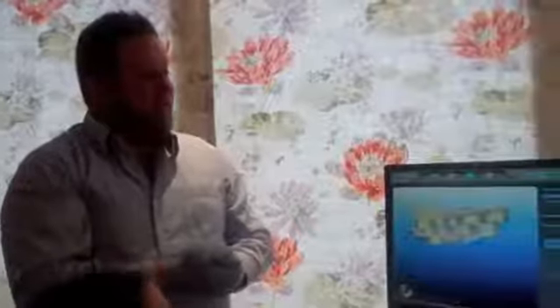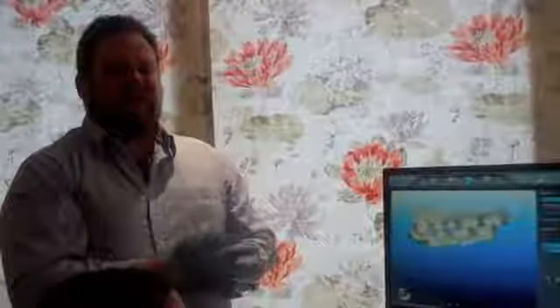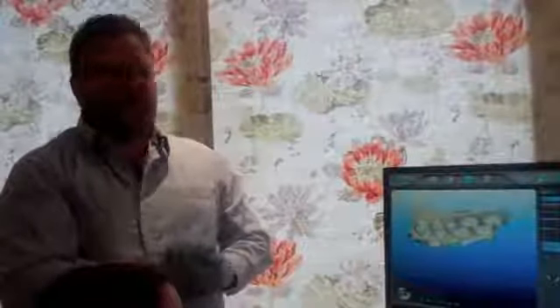Certainly an illustration of how accurate the system is. And when we first got the system, we checked this very intensively because we couldn't believe that just by taking a video scan of teeth and then putting them together we'd be able to get this level of accuracy, and that's one of the reasons we're now using this technology primarily for our implant work as well.